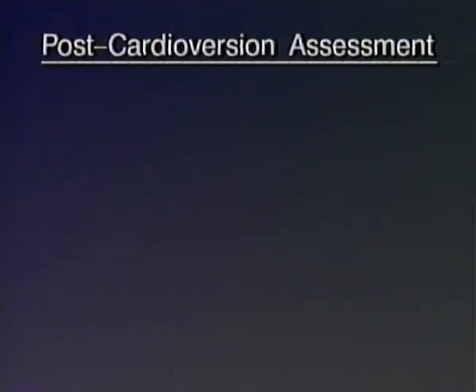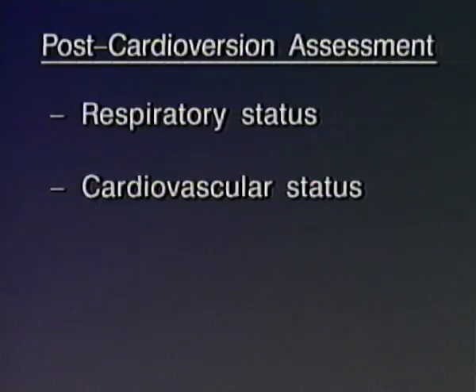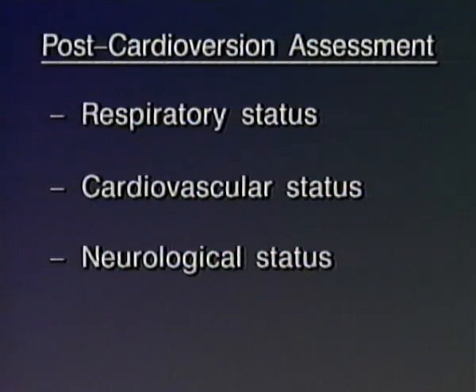Following successful cardioversion, it is important to check the patient's respiratory status, cardiovascular status, and neurological status.